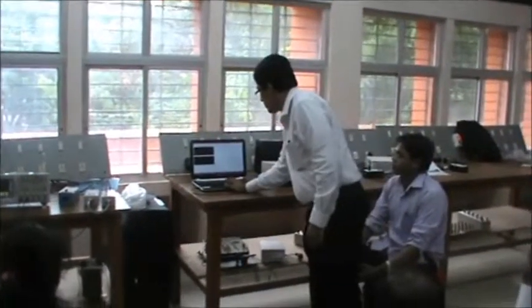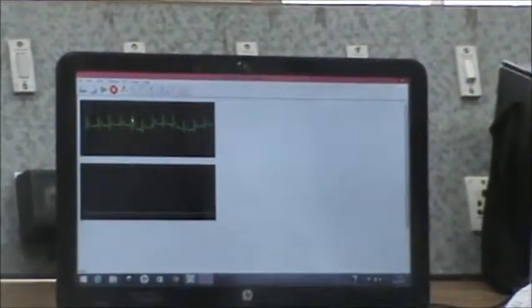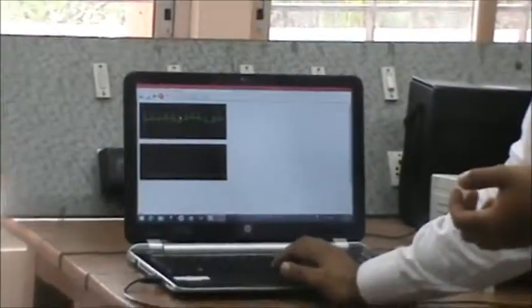So you are able to get the ECG now. I can vary the speed basically, slow, medium or high based on the time. And then you can even place markers just like how you did it on an oscilloscope and do various measurements, apart from the recording facility. So let us try to record this now.